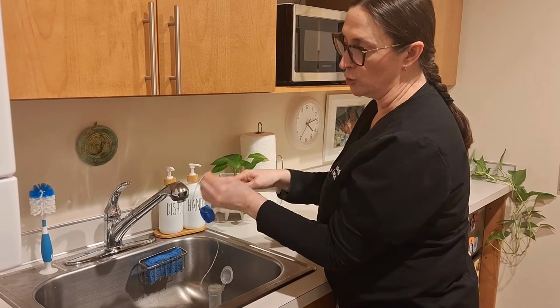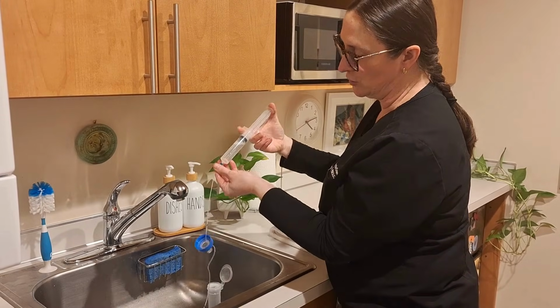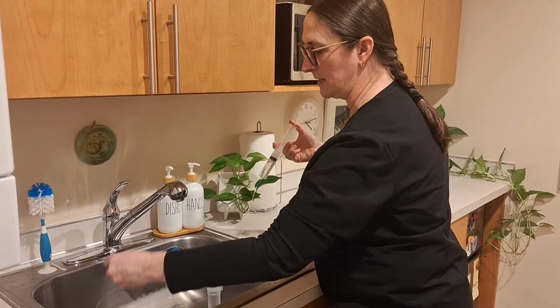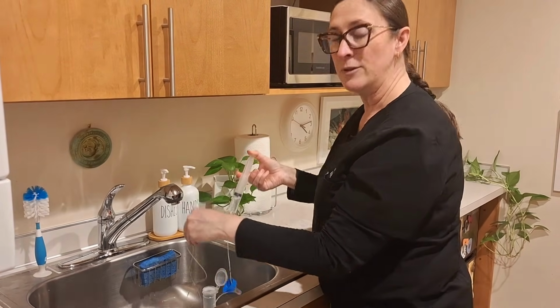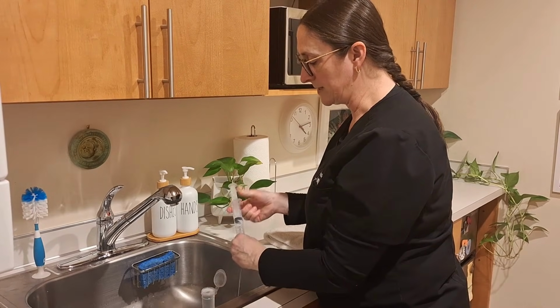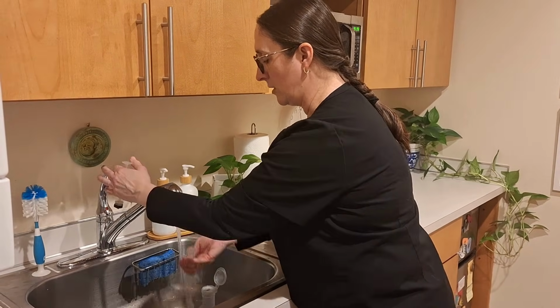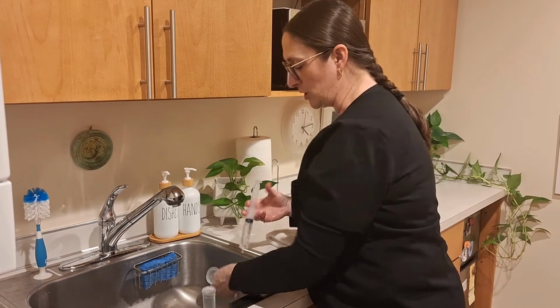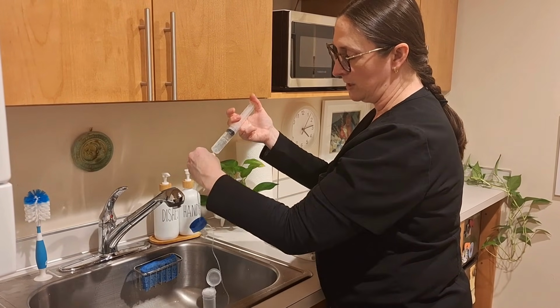This is a luer lock connection. There are different tips for different syringes and tubes. I just flush it through, and you'll see it cleans all the way out to the end. We keep cleaning it, and you can rinse and repeat as many times, finishing with a round of fresh water and getting it all cleared out. And when it's fully clean, you can even flush it with some air and hang it to dry until the next feeding. But do keep it clean.